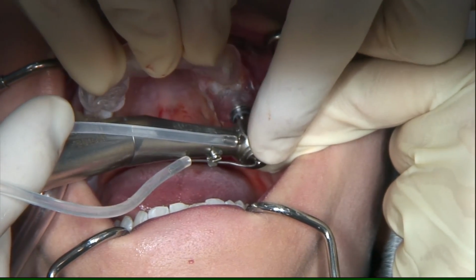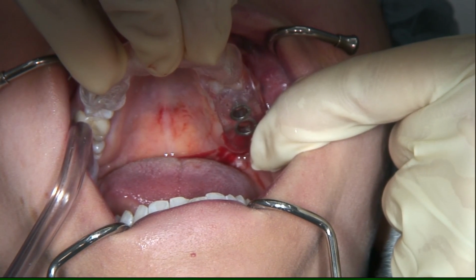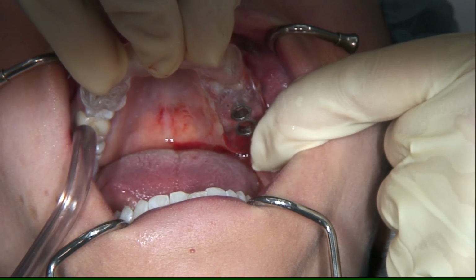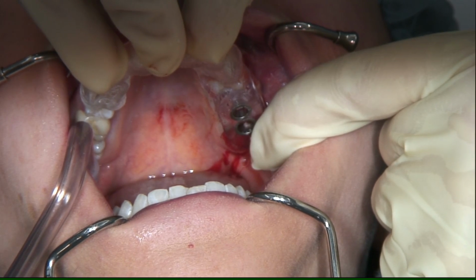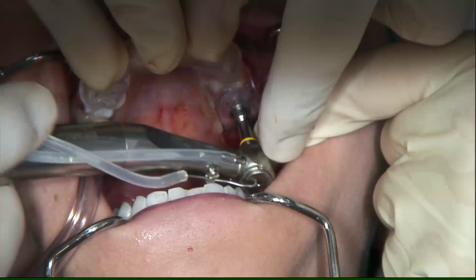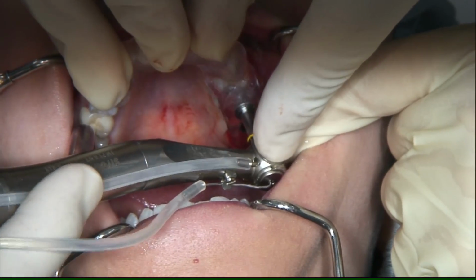So this is the 3.4 millimeter diameter. So we go in an ascending order through the sizes. We have different colors. So the last color will be yellow, which means, you see here now, 3.8 millimeters diameter.